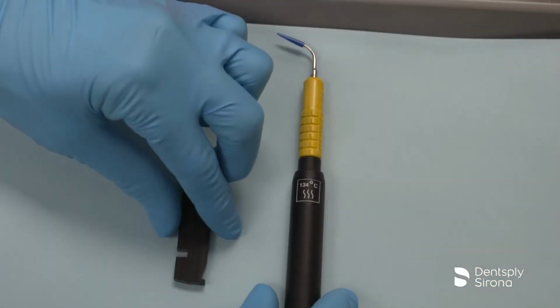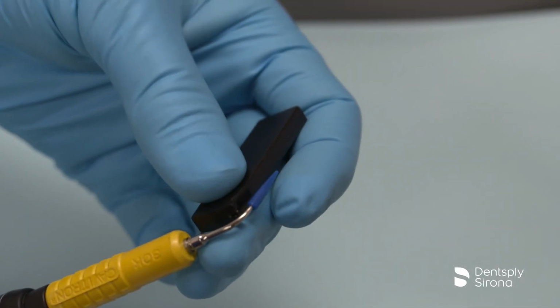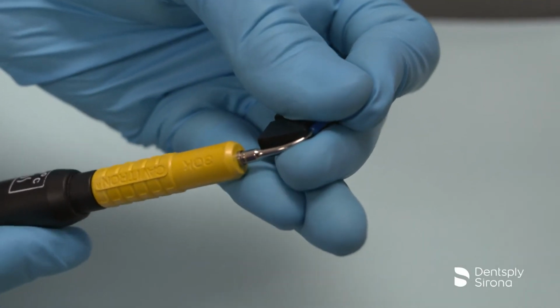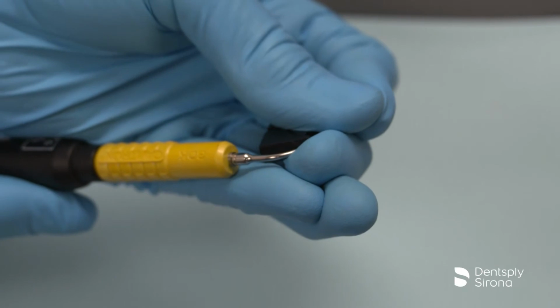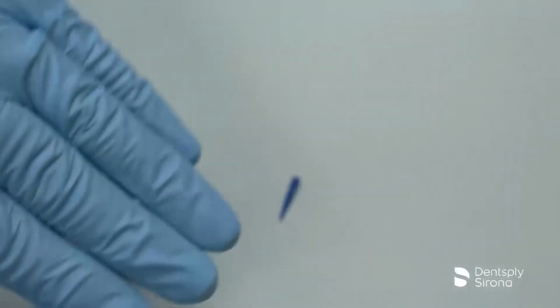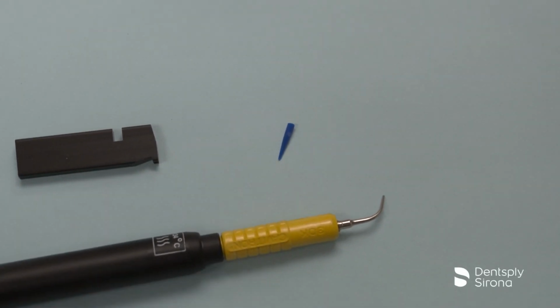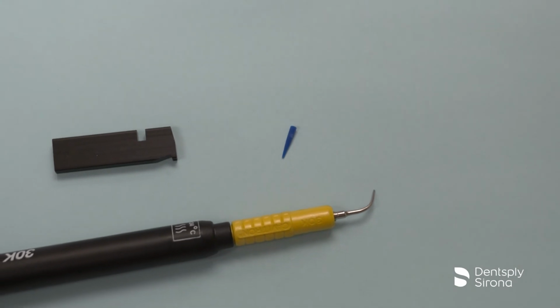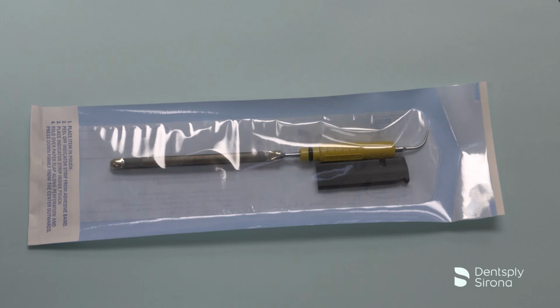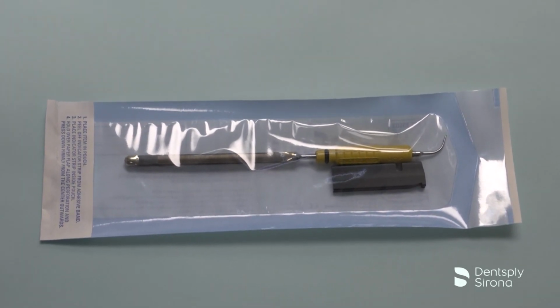To prepare the insert tip for sterilization, keep the insert in the handpiece and place the tip into the slot on the wrench. Place your thumb and index finger over the disposable prophy tip. Gently push the handpiece downward and the tip will disengage. Discard the used plastic soft tip disposable prophy tip in accordance with applicable standards for disposable biohazard materials. Proceed with sterilization of the ultrasonic insert and soft tip wrench. It is recommended to always sterilize the insert and the wrench together.